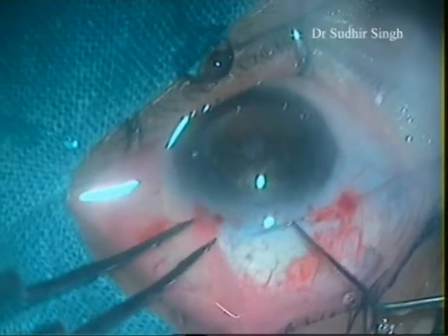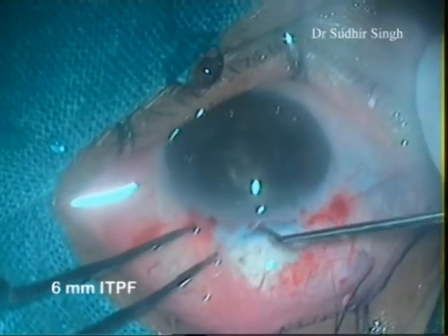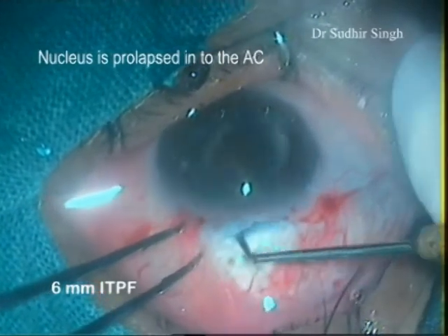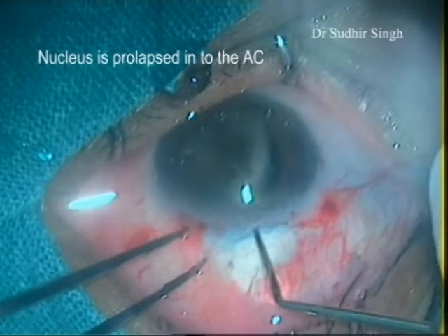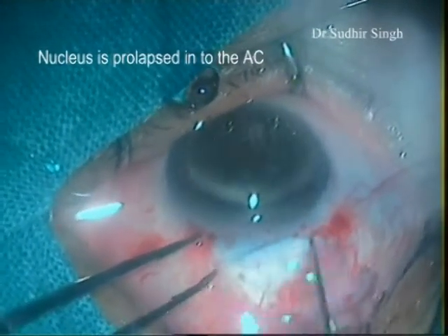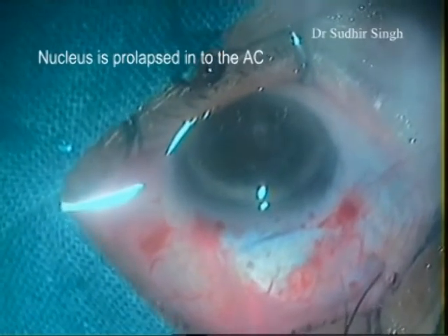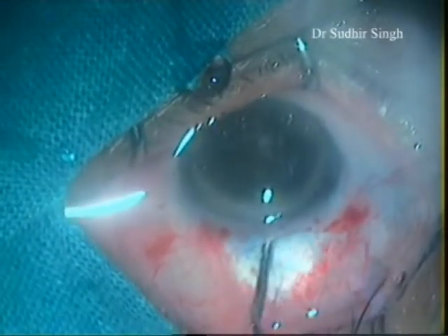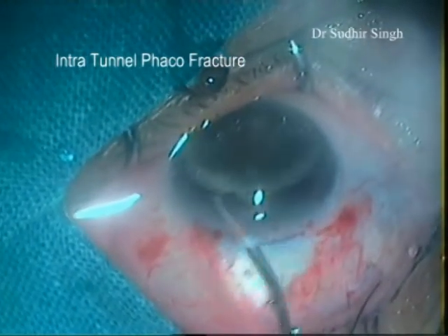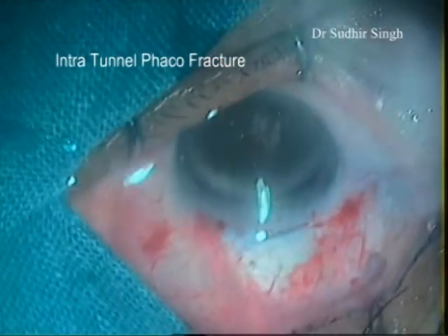The nucleus is prolapsed into the anterior chamber with the Sensky's hook. Enough viscoelastic is placed between the cornea and the superior surface of the nucleus, and between the inferior surface of the nucleus and the iris. Vectis is introduced through the tunnel and positioned between the iris and the nucleus.